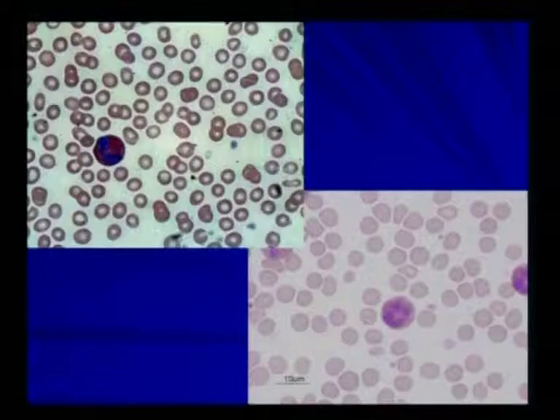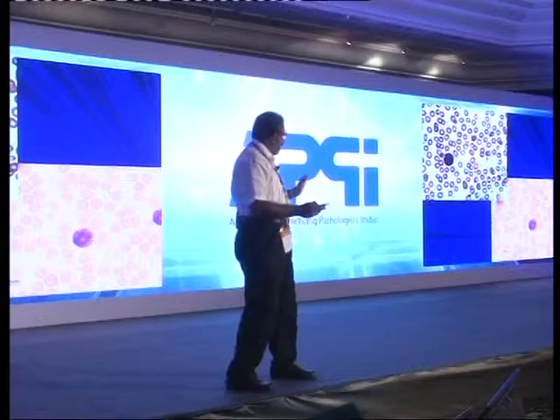So when you are confused, again a hematologist will look at the blood film. And what do I see in the blood film? You see eosinophils, look at the platelets. There are different sizes of platelets, different morphology of platelets. There is anisocytosis of platelets, there is anisogranularity of platelets. There are platelets which are almost gray platelets. There are platelets with 1 or 2 granules, there is anisogranularity.